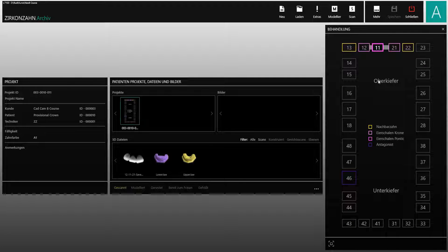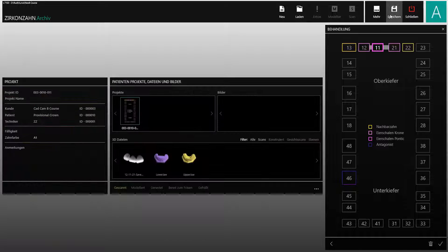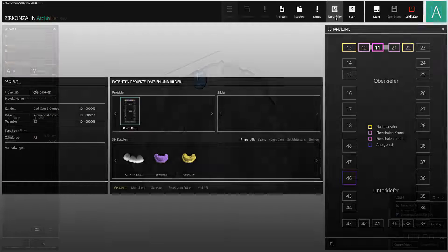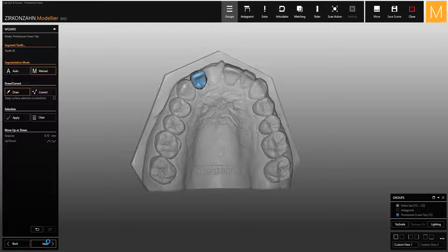This video shows how to switch from eggshell pontics to anatomical pontics during the design phase. If you have selected the wrong reconstruction type in the ZirconZen archive software, you can now convert the pontic directly in the ZirconZen modeler software.